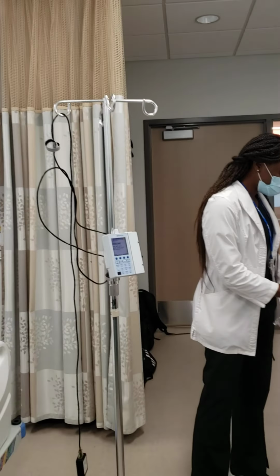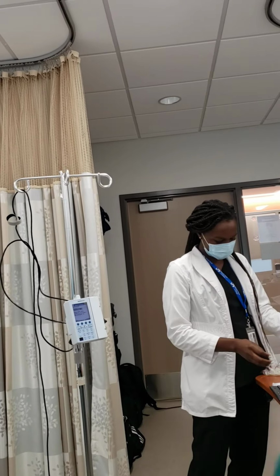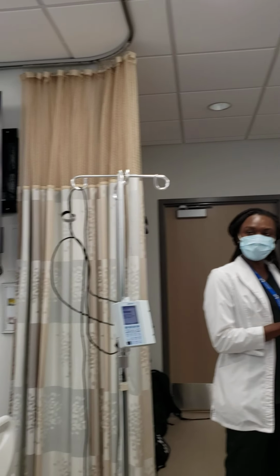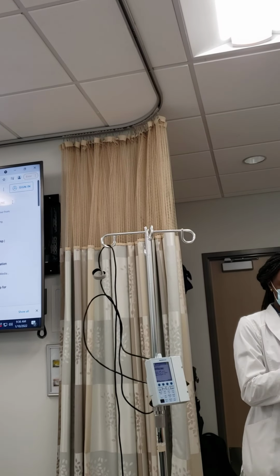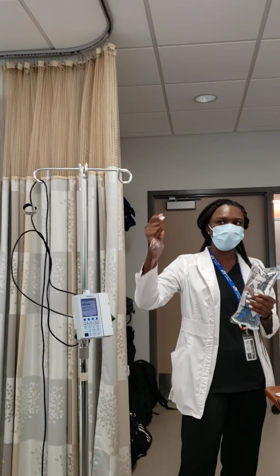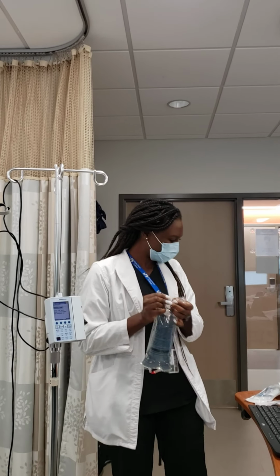All right. So of course, I have a quick question. The pump only has one connection. Let's say, for instance, you have two of them, like the primary and the secondary. For the pump, how do you set it up? You can do it in the same connection. That's why it's called secondary, because you connect your secondary line to your primary line. I'll show you. Okay. Professor, can you mention what are the supplies that we need?